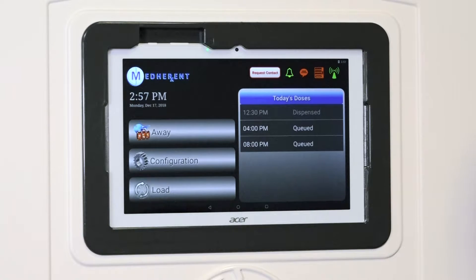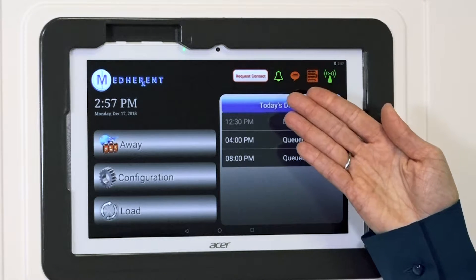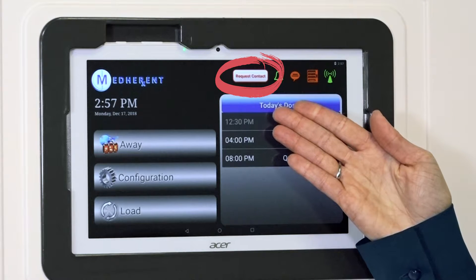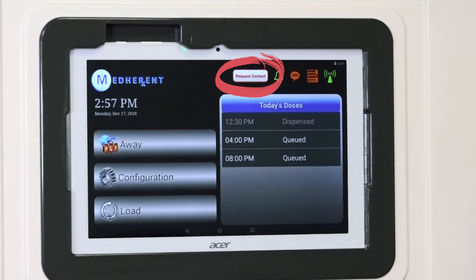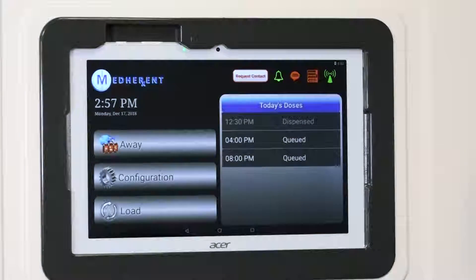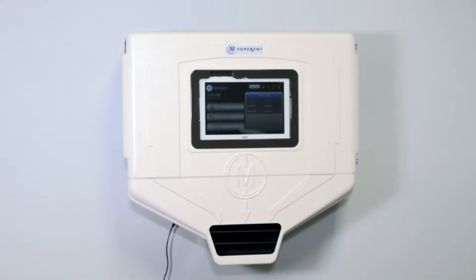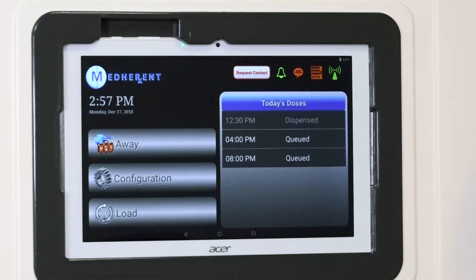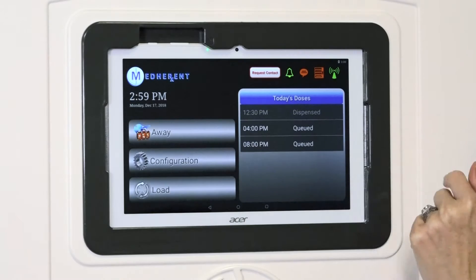We are constantly working to improve and further develop Medherent. This request contact button anticipates a future functionality that we will build into the system to allow patients in need of help to contact their physician or caregiver. This feature is still in development, so nothing will happen if you push this button right now. We will keep you updated on when we are ready to go live with this feature. In the meantime, please do not push the request contact button.